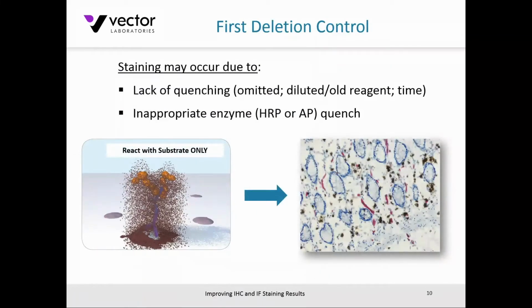So there was a little bit of PowerPoint magic there. We've got just applying the enzyme substrate onto your tissue preparation. And if you do see any staining with this particular deletion control, it could be due to one of these factors that I've indicated here. It may have been inadvertently left out or omitted from the workflow. Potentially, it may be further diluted than what is required for the amount of enzyme that's present, or indeed it might be past its expiration date, or indeed there is a time factor there. Maybe it needs to be applied for a longer period, for example. This might be in cases where you might have increased vascularization, as I mentioned on that other heterogeneous tissue block slide.